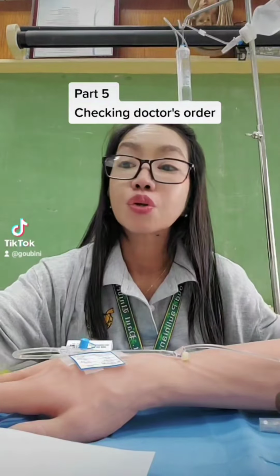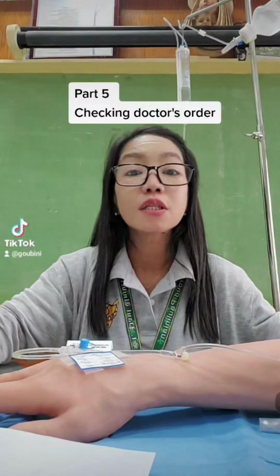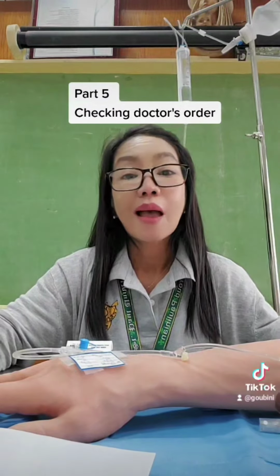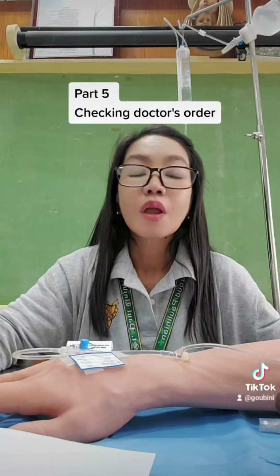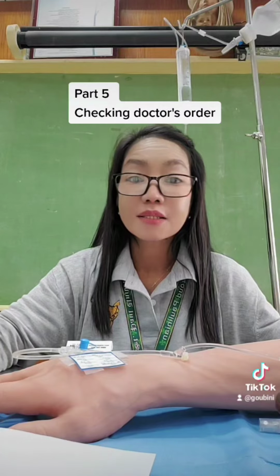In the physician's order sheet, your order reads: administer medication Cefepime 500 milligram IV every 12 hours to run for 30 minutes, reconstitute in 50 cc NSS.